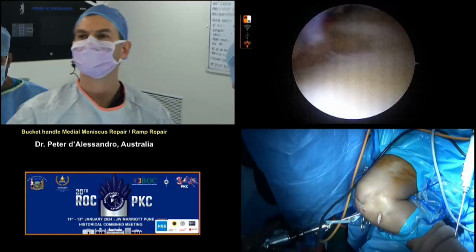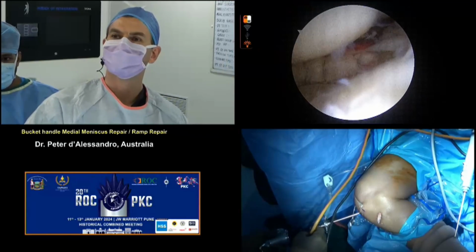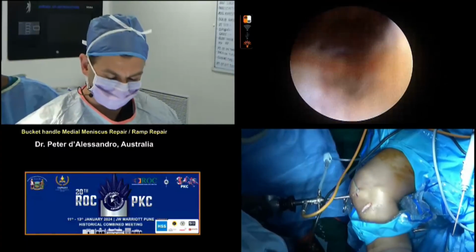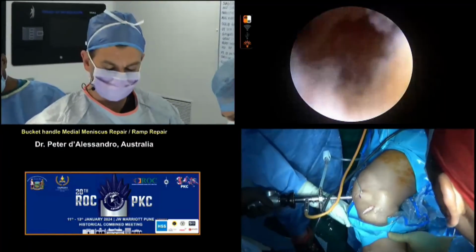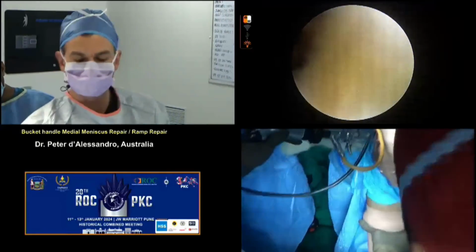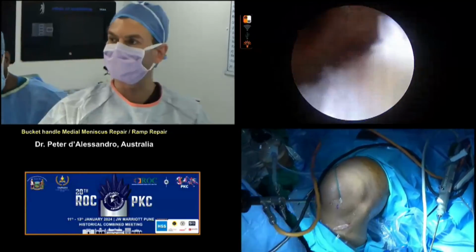The lateral side can potentially heal. You've got a nice big giant hole in the femoral condyle right there to give you bone marrow. And anything else you would do? Because I think we're coming on time right now. Yeah, no, I think that's it. I completely agree with everyone. Less is more. So now we're going to go back and quickly pass our ACL graft. But from a fixation point of view of those menisci, we are happy.